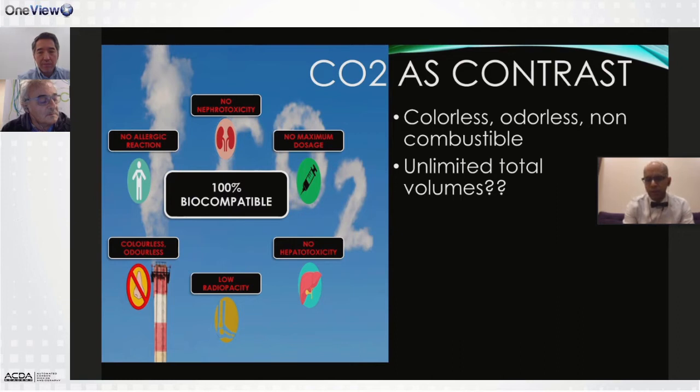There's no allergic reaction, and it does not affect the kidneys or the liver. It's very compressible, and of course it's cheap, which hospitals are going to love. I know Dr. Manzi is going to be talking about this and how the cost saving of using CO2 as a contrast agent helps out in the long run.